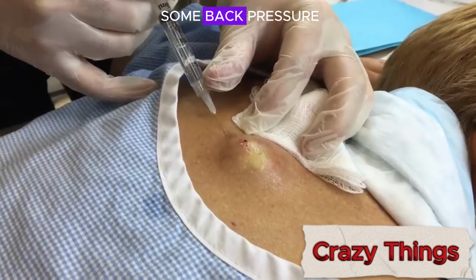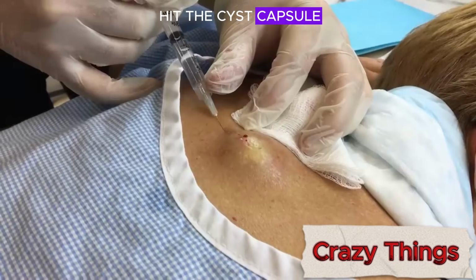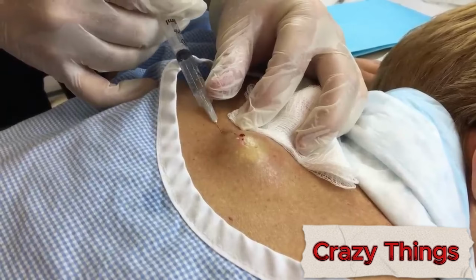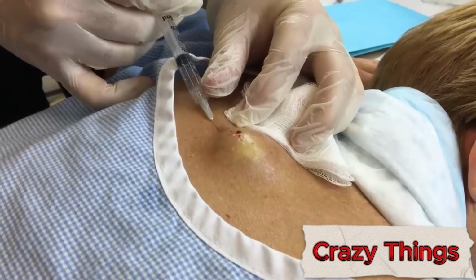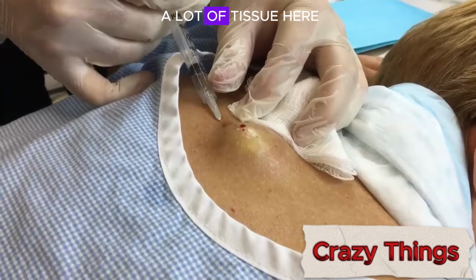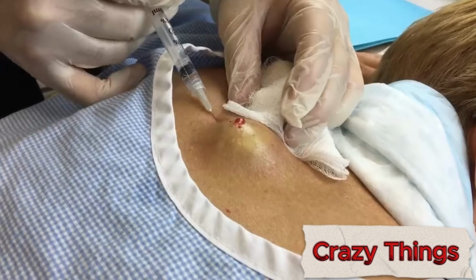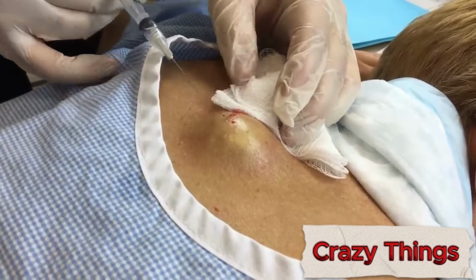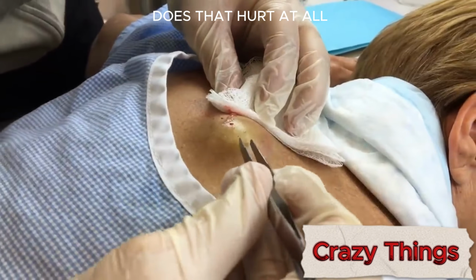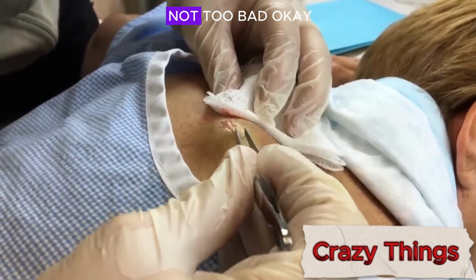and you'll probably see some back pressure because this seems like a big cyst. So if we hit the cyst capsule, we'll start to see that it swells. You okay? And I oftentimes find with residents there's fear that you're going to go right into the spine, but you actually have a lot of tissue here, and that's really not realistic. So you start to see there the pressure's coming up. So I'd still check. Does that hurt at all? No real pain there. Not too bad. Okay.